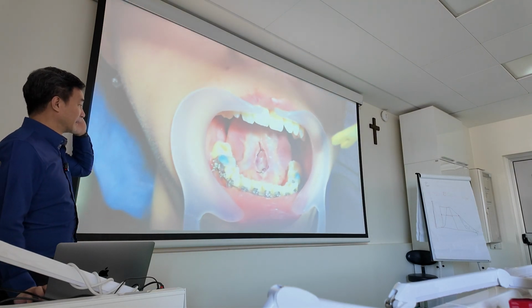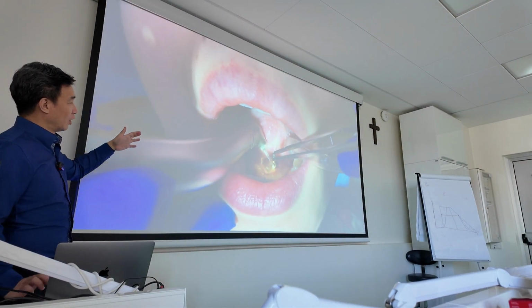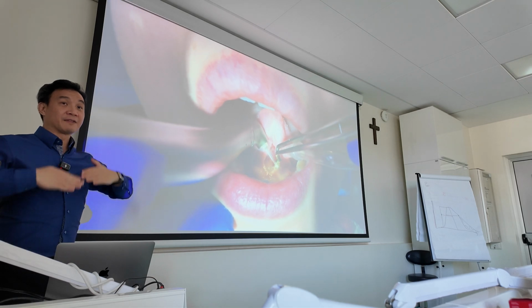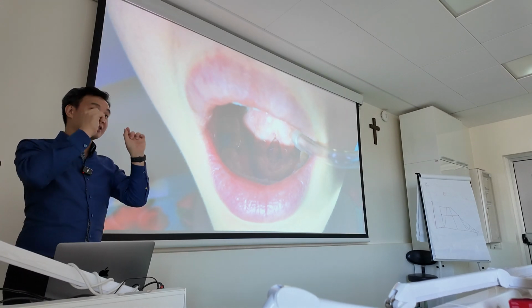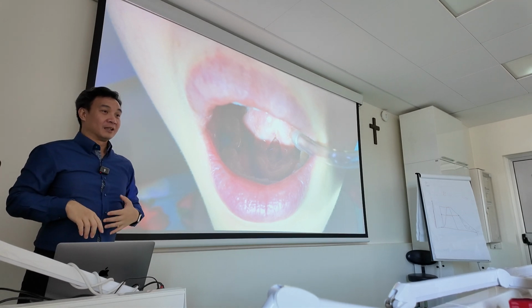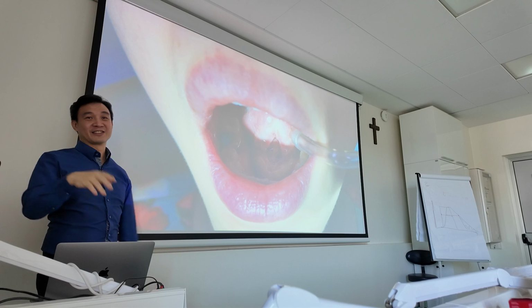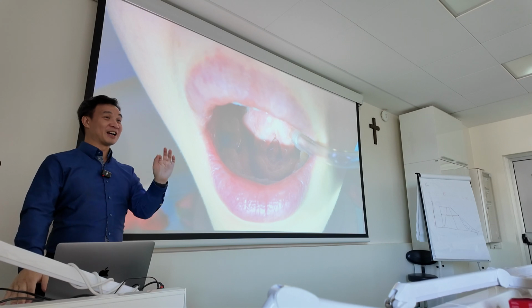So after that last bit, then we will go ahead and release the. So I always love my laser for this purpose also, for stitch removal. Sometimes my oral surgeon, after he raises some flaps to do augmentation and all, this kind of stitches is right at the sulcus. And it's so short that when you pull, it's uncomfortable. Then I will pull out my laser and do my stitch removal. Then you pick it up, patient doesn't even know that you removed all the stitches already. Yeah, but of course it's a very expensive tool to just do stitch removal. But since you have it, why not?